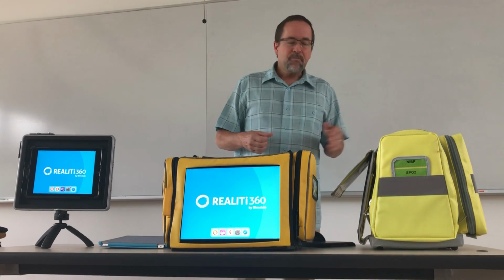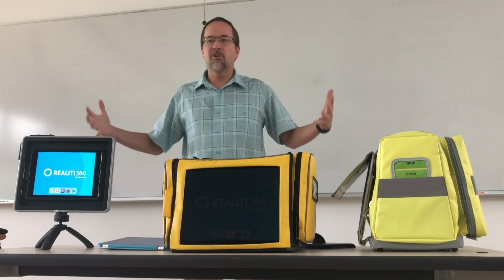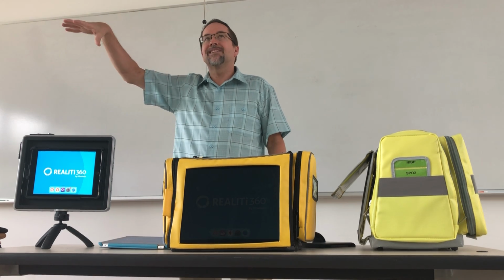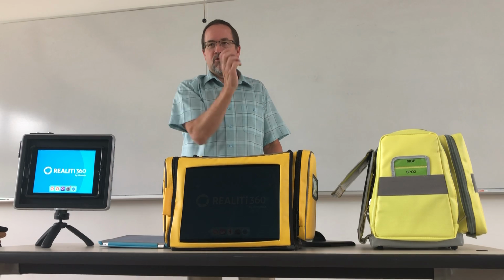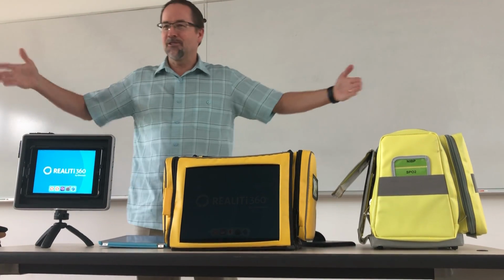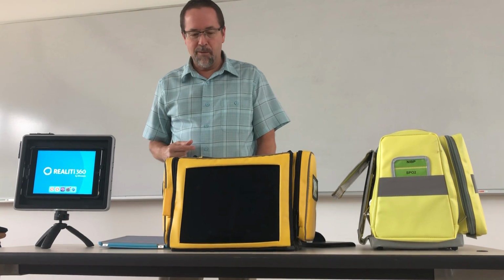What's the range on the router? I don't know. I know part of the reason they went to the bigger one is because it has a better range, but I don't know what the range is on it. I know we've done it where we had the router plugged inside and gone outside of the building to the ambulance, and it was still working there. It wasn't until we drove away that we realized that the router was still inside the building, and it disconnected. But at least it would go from inside our building to just outside and through a little bit of wall. But I don't know how reliable that is.